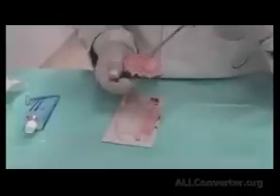We spread the material, making sure it has even thickness all around. We cover all of the sulci with the impression material. And now we're ready to take the impression.